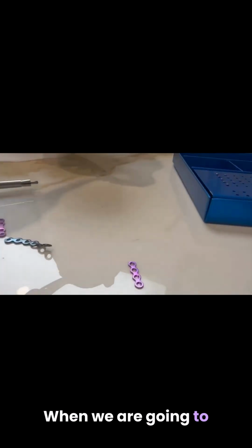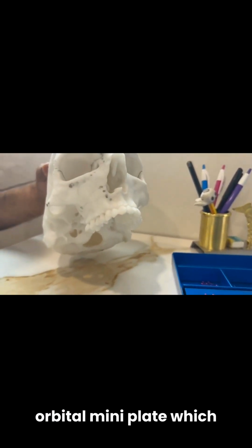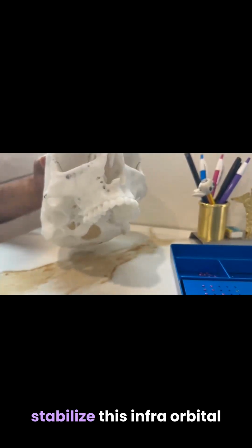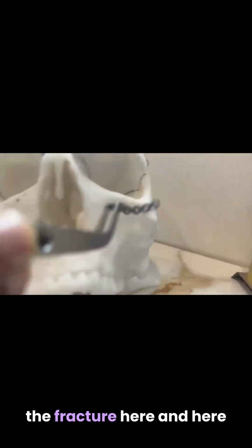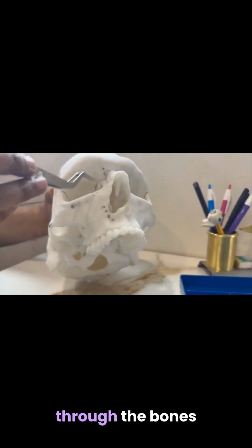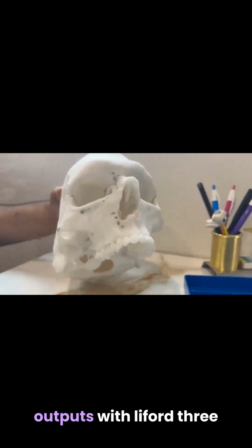When we stabilize the infraorbital rim, we have to go for an orbital mini plate which stabilizes the infraorbital rim on both sides of the fracture, here and here, because the fracture line passing through the bones involved has multiple outputs.